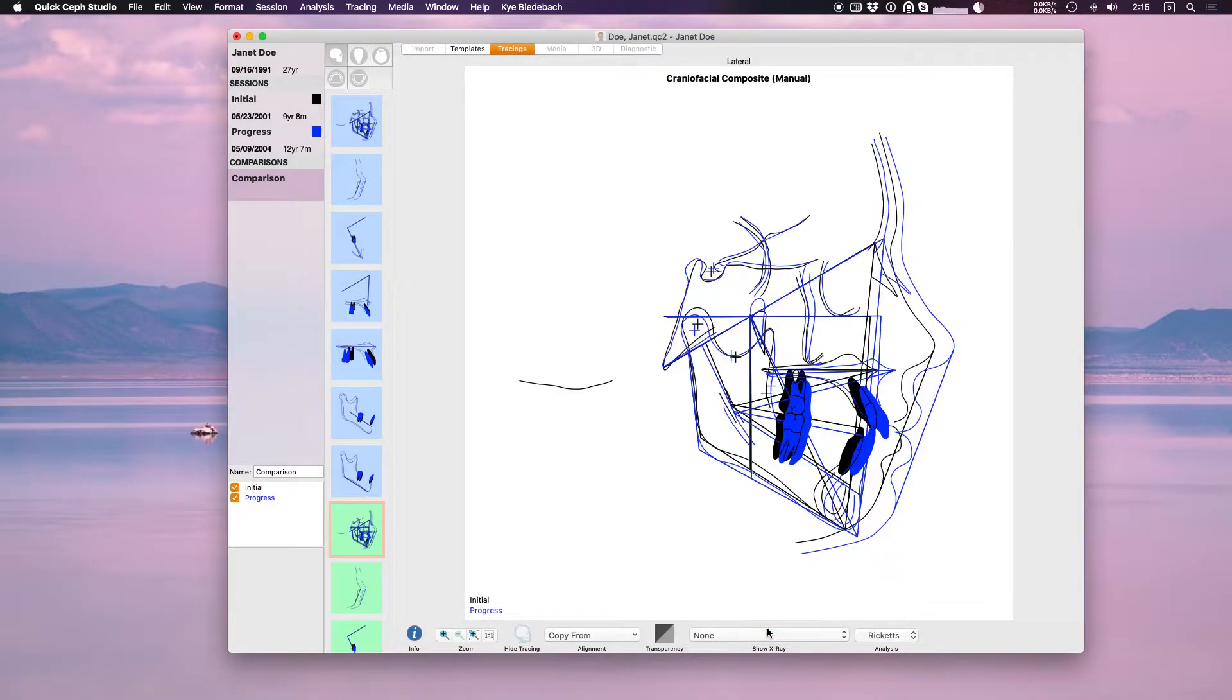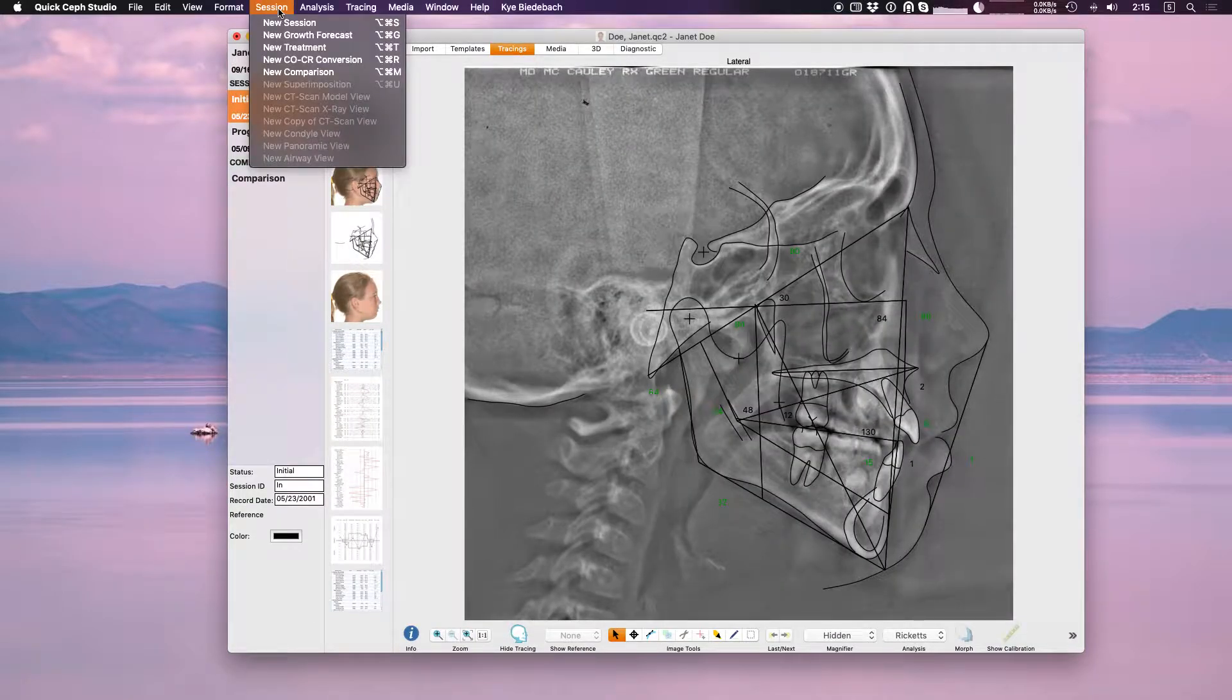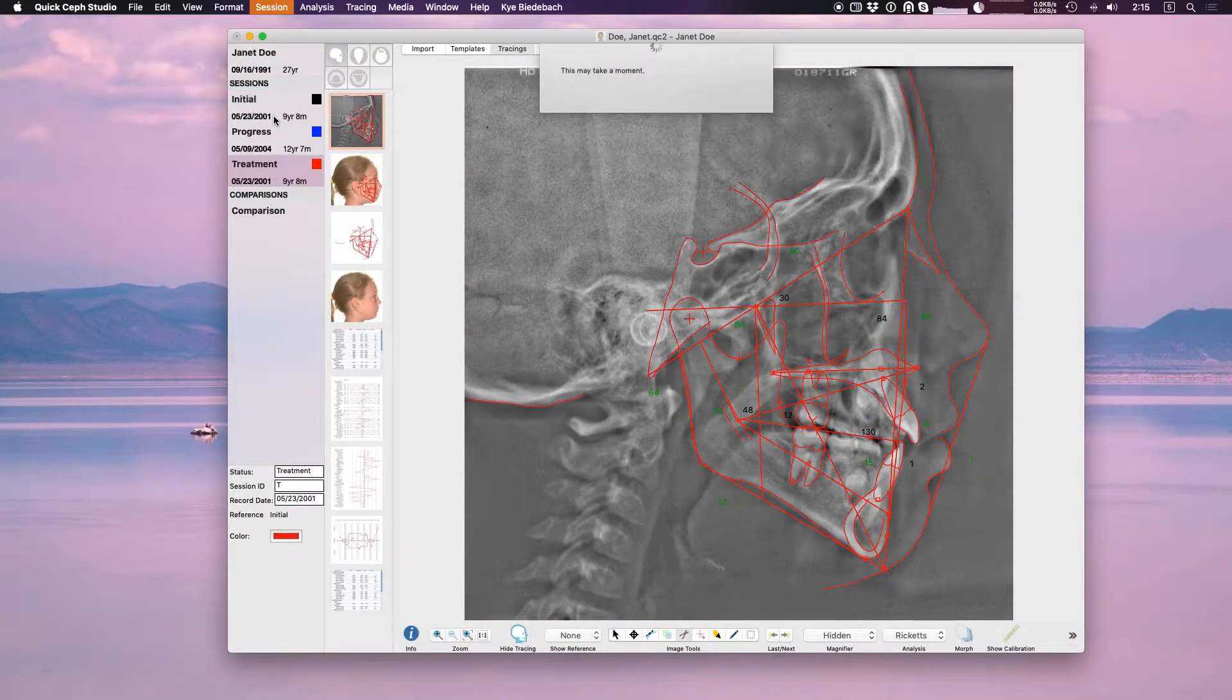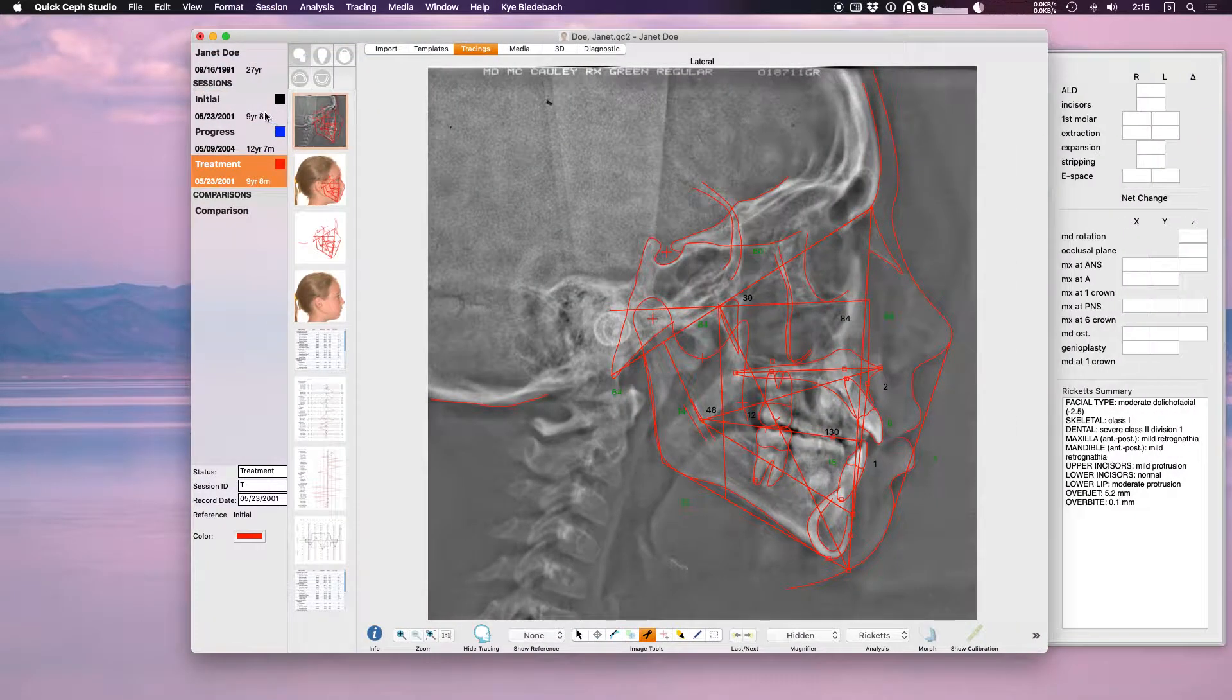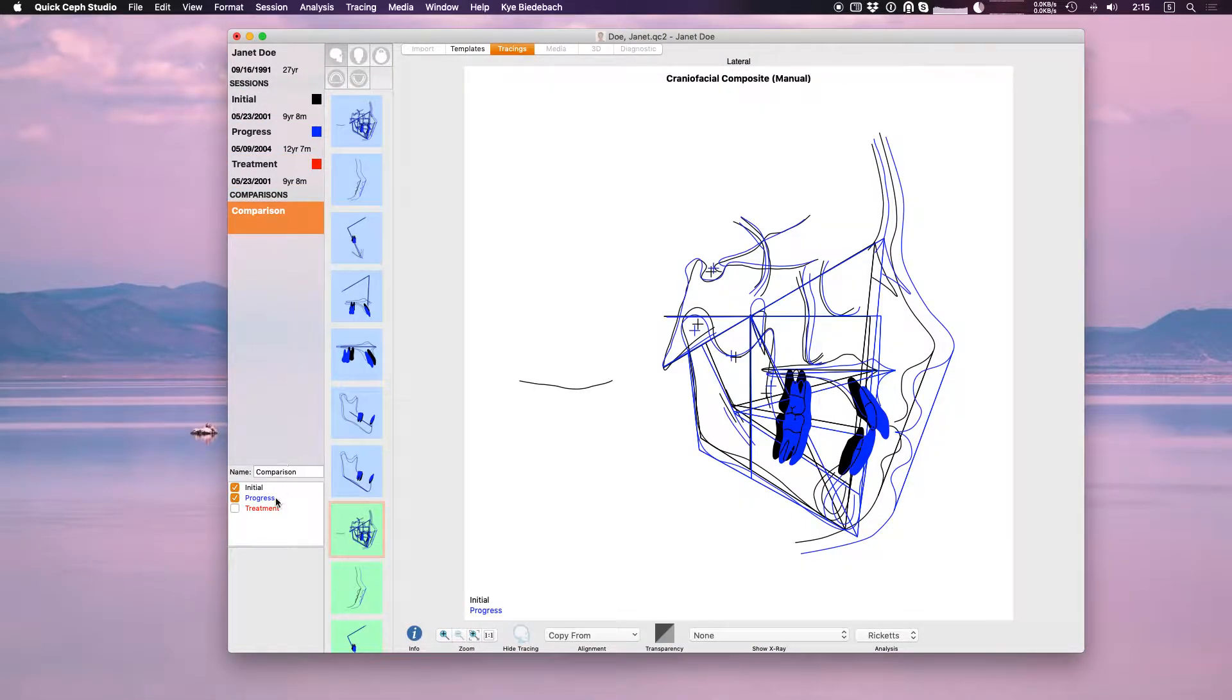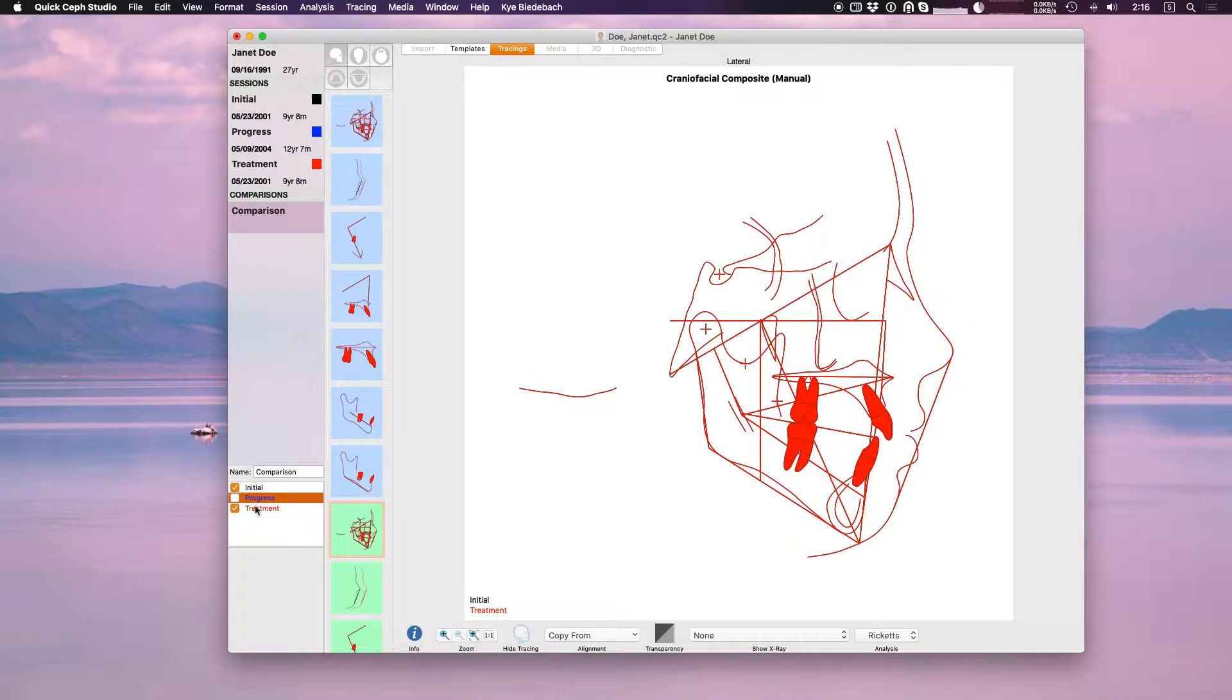Let me give you one other example. Let's make a new treatment of our initial. That way now we have an initial, a progress, and a treatment. So now if we go to comparisons you see now we're comparing initial and progress. Let's add treatment in there. So now we're comparing all three. Maybe if I just want to do initial and treatment I can uncheck progress, now it's just initial and treatment.